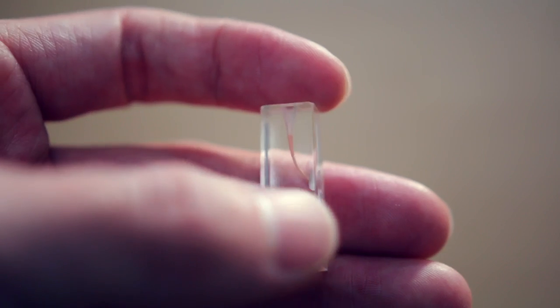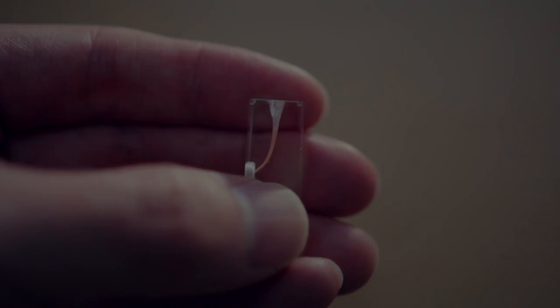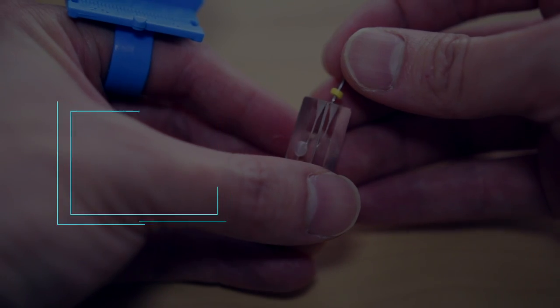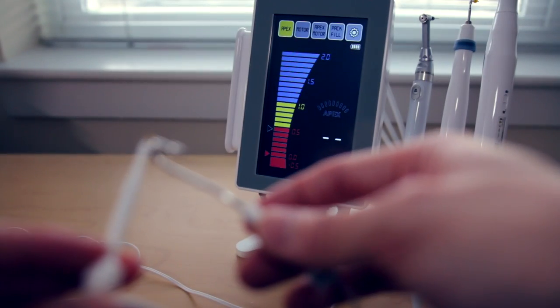Today I'm going to demonstrate how I do a root canal using this J-shaped clear acrylic block. So basically after the access, I play it safer most of the time by using a K8, 10, or 15 hand file to get the glide path to the apex and find the working length. The apex locator works really well, and I find it's a little more flexible in different conditions — whether it's on the drier or wetter side, or whether it's a smaller or bigger canal. And it kind of sounds and looks like this.